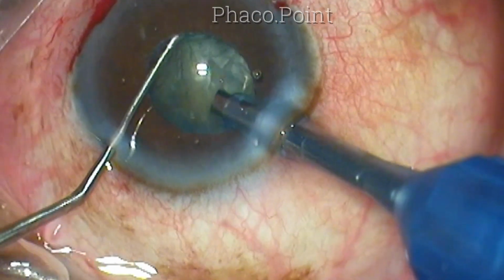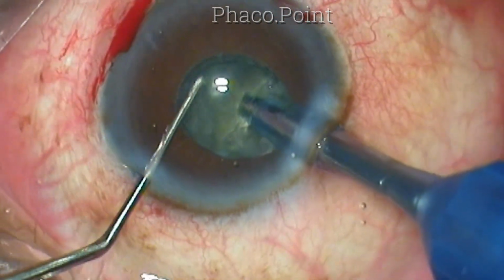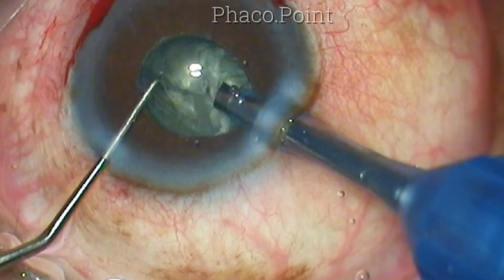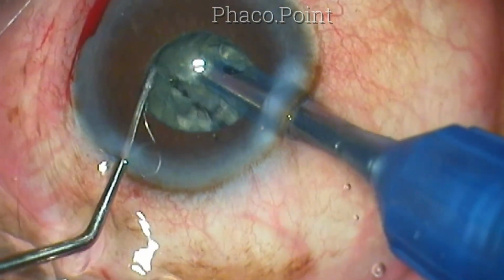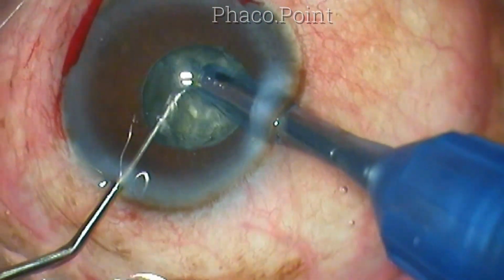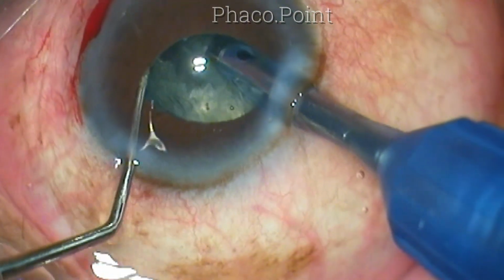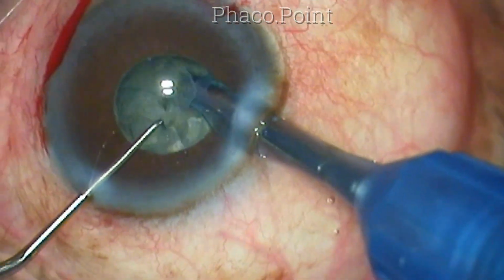This is possible when you are performing the direct phaco chop by just impaling the phaco needle or the phaco tip into the nucleus substance and using the sharp chopper to just break this nucleus down into smaller fragments. In a small pupil, always aim to create more than 4 fragments. At least 6 fragments would be a good idea because this will help you a great deal while you are mobilizing the nucleus fragments.